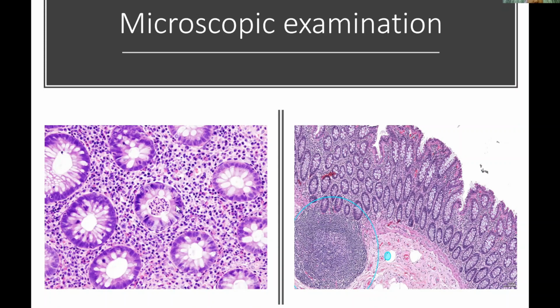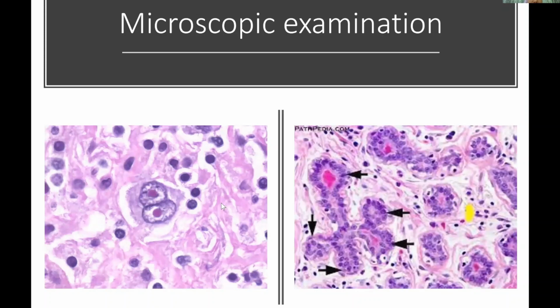Okay, again in the histologic examinations, these are sections from the lymph nodes. This is the tumor cells, the Reed-Sternberg cells. You can see binucleated cells with a very prominent eosinophilic nucleoli. Okay, this is actually Hodgkin cells. This is a Hodgkin cell with the surrounding reactive inflammatory cells.